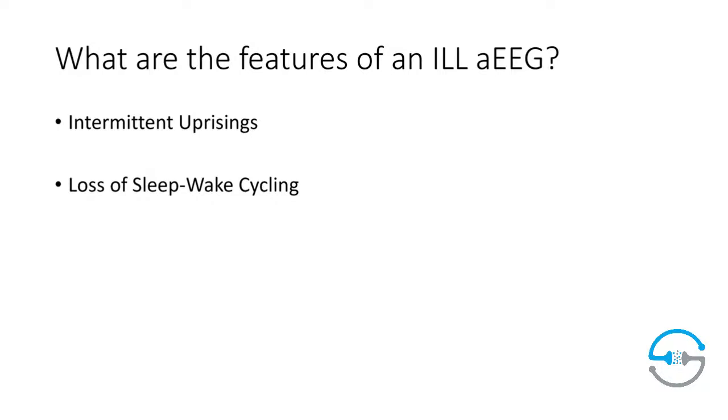The other time we have that loss of sleep-wake cycling is in our mild HIE babies. So babies who are being evaluated for cooling. We saw this a lot back in the CoolCap trial, where the kids would be evaluated with aEEG, and we would see that they would have okay backgrounds, but they would be lacking sleep-wake cycling. So really that reemergence of sleep-wake cycling really is a sign of the brains being well, and they're able to then organize those kind of cellular communications that have to happen in order to synchronize that activity.